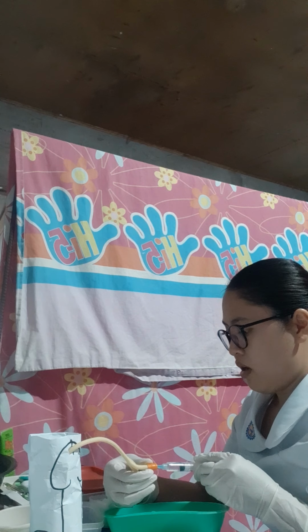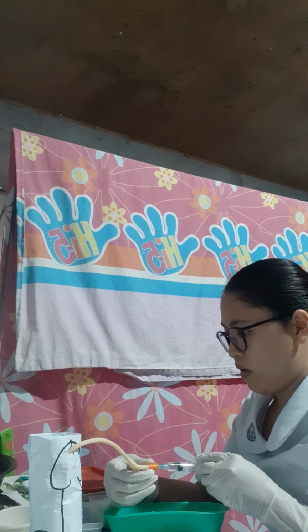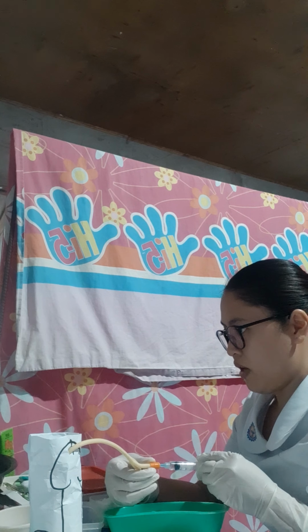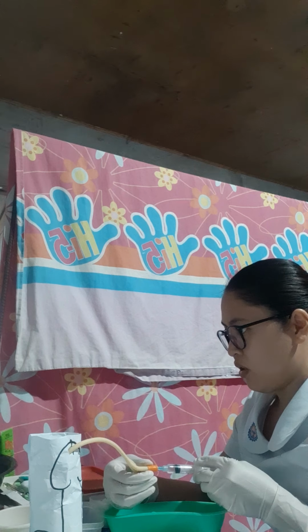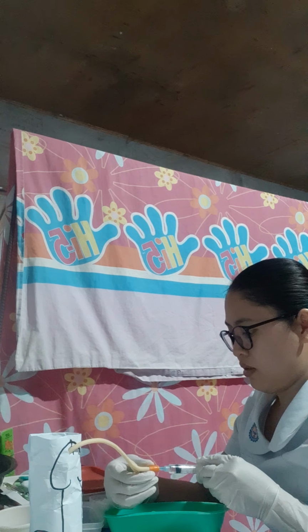Then after inflating the balloon fully, release the catheter with the non-dominant hand and pull gently to feel resistance.